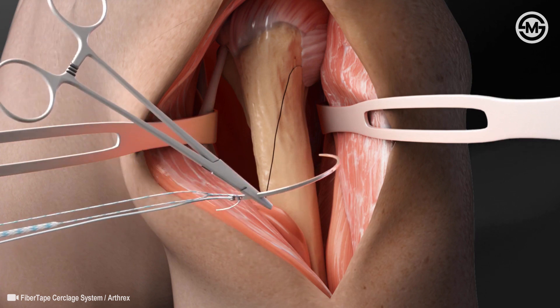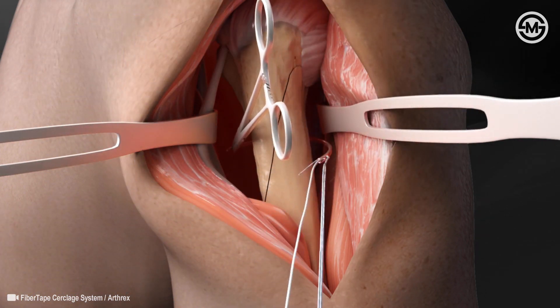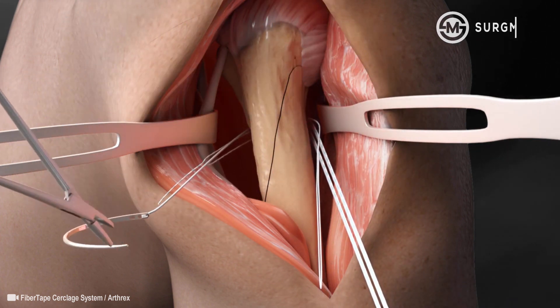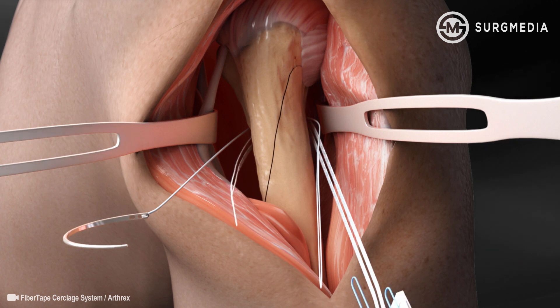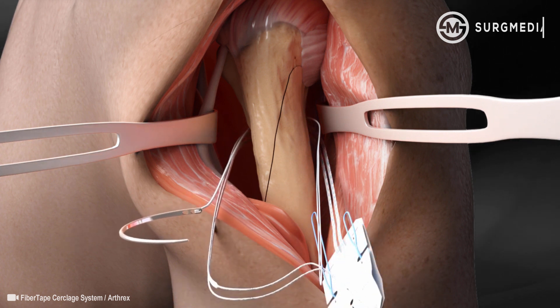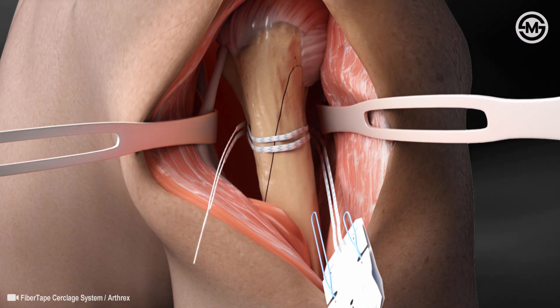A blunt needle can be used to pass the circlage suture around the fracture site. The circlage suture tail is loaded into the eyelet of the needle and then is passed around the bone. Once the needle is fully passed, you remove the Fiber Tape tail from the needle and load it into the suture shuttle loop that is attached to the needle to facilitate a second pass around the bone.